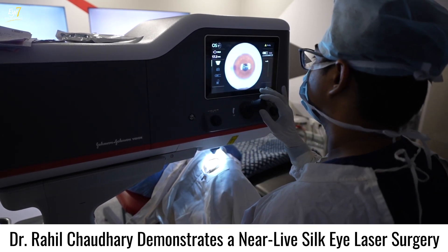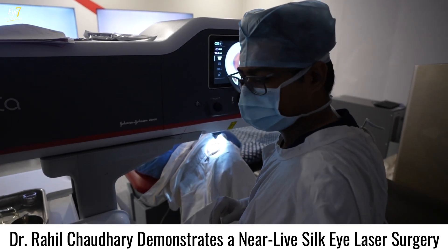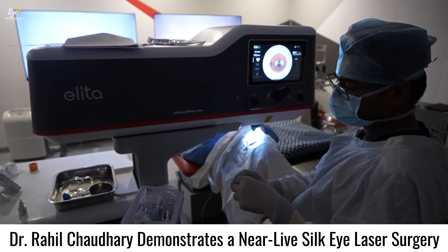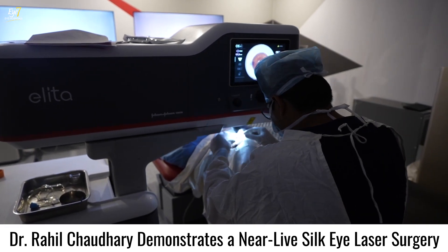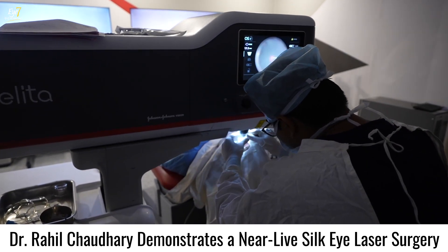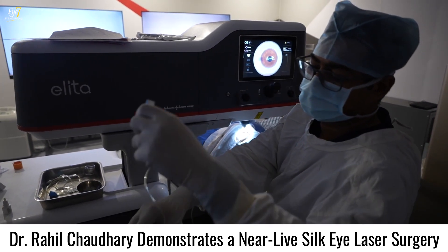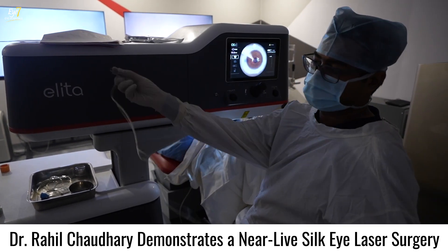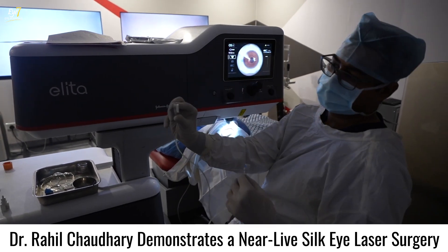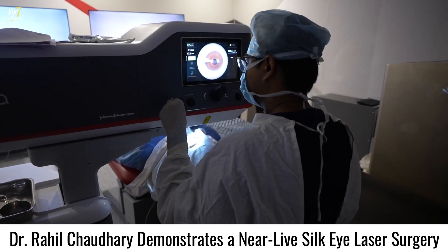The eye is nicely centered and we proceed to the next step. This is how the patient interface looks — it is a two-piece interface. The first is the cone, which goes onto the laser head, and the second is the suction ring. The beauty of the newer Johnson & Johnson machines is that the suction is now automated, unlike the older machines. The cone goes onto the machine nice and firmly.